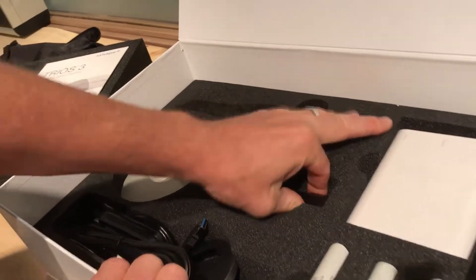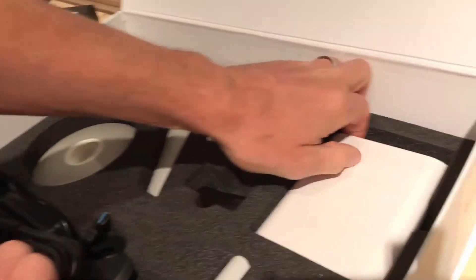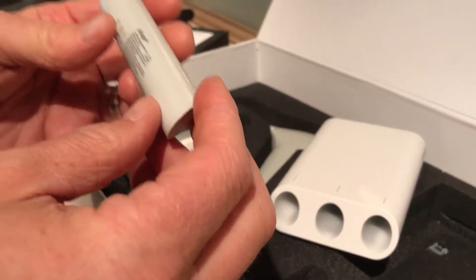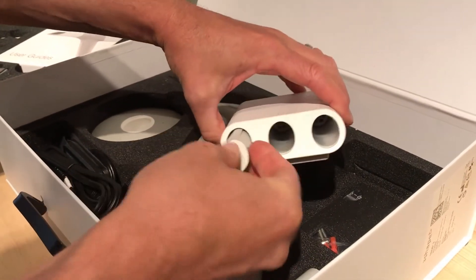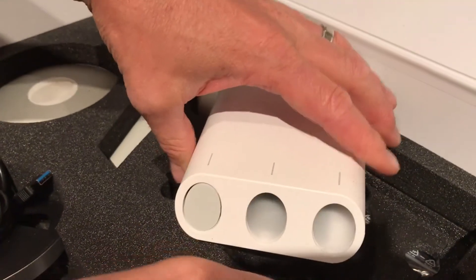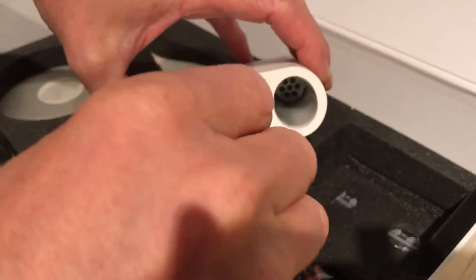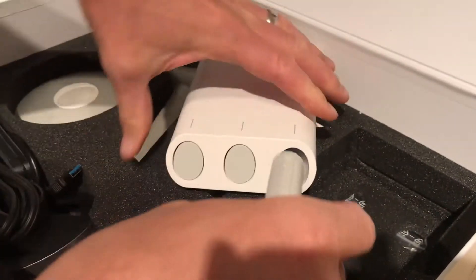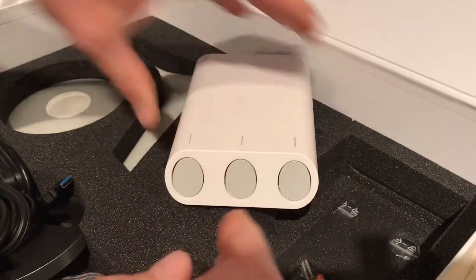You have your calibration object here, which I'm just going to pull out. And then you have your battery charger and your batteries. As you can see, these are Three Shape rechargeable lithium batteries. These would just go right in and click in — they snap in. They have a little key-way notch so you can't really mess it up, and then they simply snap in like that.